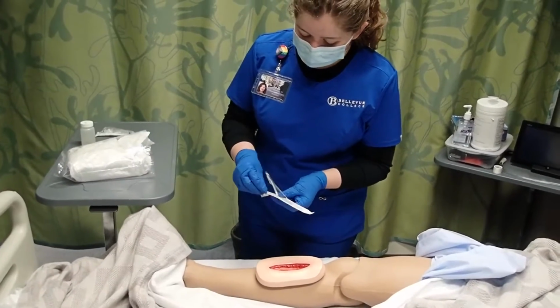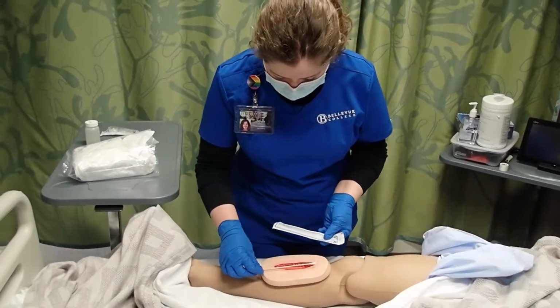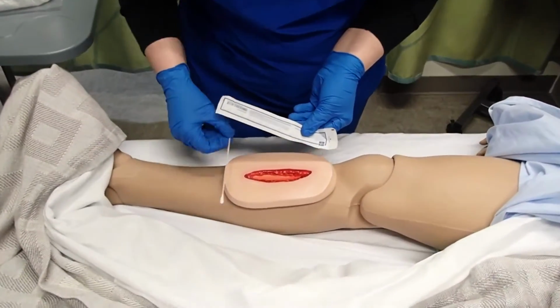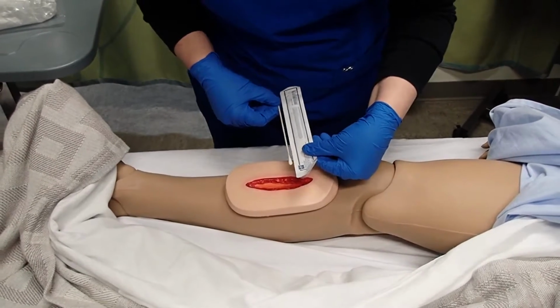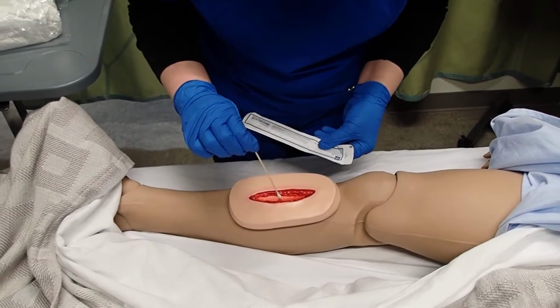My measuring stick. So I will measure the length and measure the width. I'll very gently measure the depth.